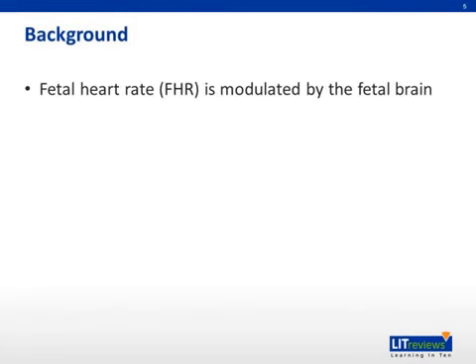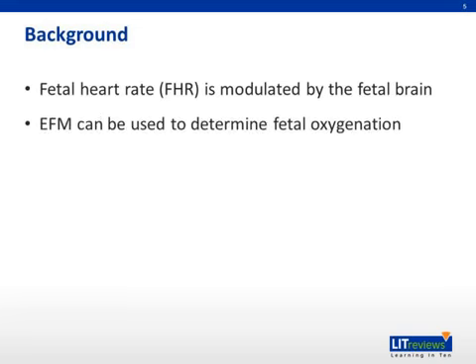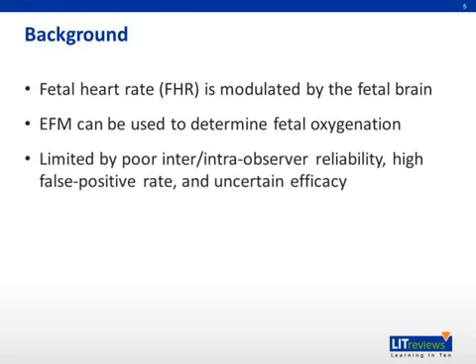First, I'll review the background. Fetal heart rate monitoring is modulated by the fetal brain. The fetal heart rate is determined as a balance of the parasympathetic and sympathetic tones. EFM can be used to determine fetal oxygenation. EFM is limited by poor inter and intra-observer reliability, high false positive rates, and uncertain efficacy. The frequency of EFM utilization has increased from 45% in 1980 to 85% in 2002.